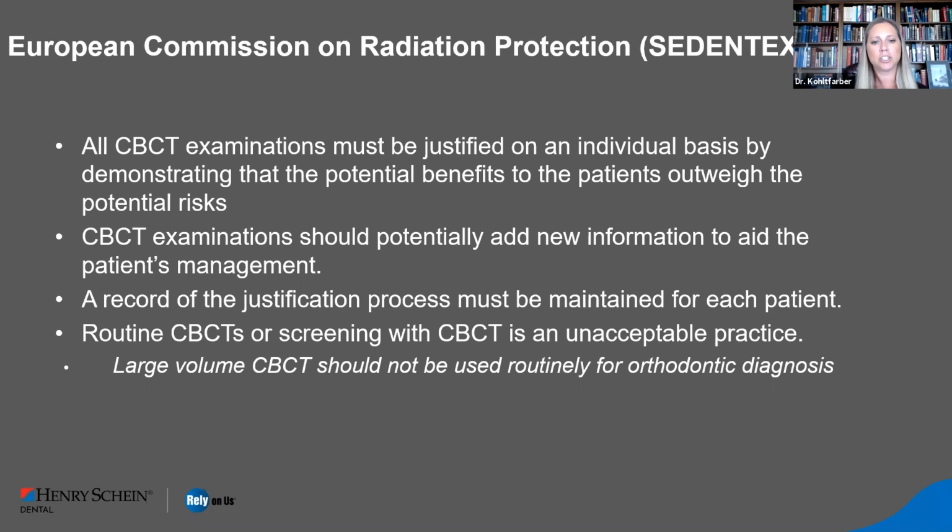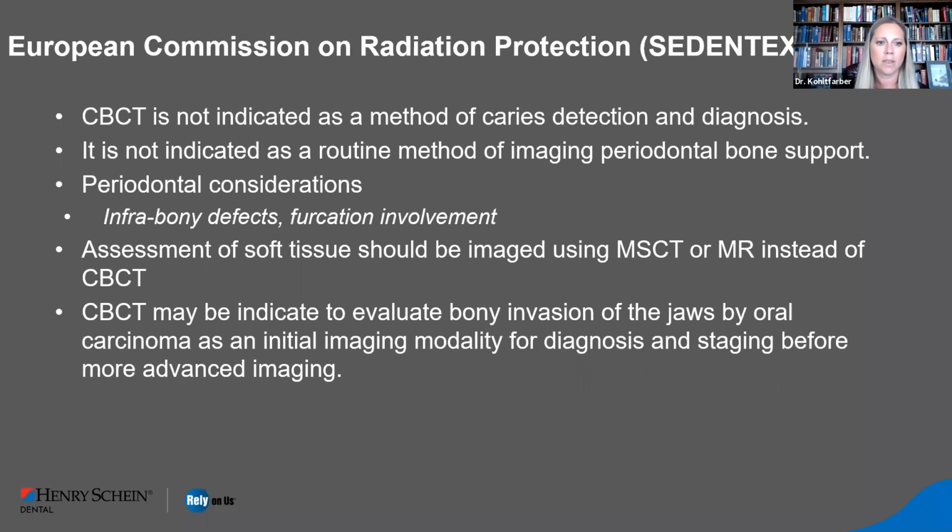The CBCT examination should provide new information beyond what 2D imaging would show and aid in that patient's management. You need to have a record of that justification within your charts. That must be in the chart for each patient. And then routine CBCTs or screening with CBCT, they feel is an unacceptable practice, where large volumes should probably not be routinely taken on every orthodontic patient, for example. And again, looking more at those advanced cases and that sort of thing.